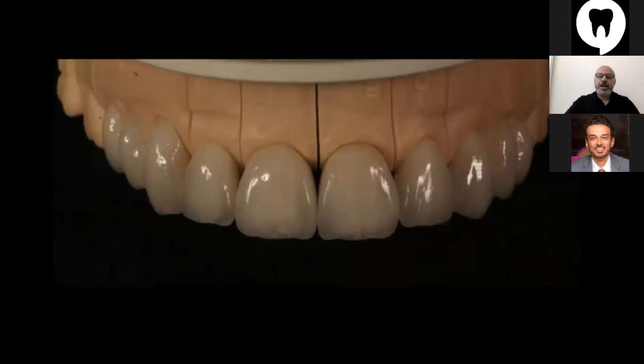So this is the final, without any layering, just milling and texturing, just finishing, artistic finishing, as we're saying, and of course the artistic skills of staining and coloring the teeth.